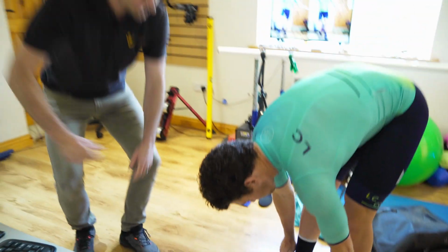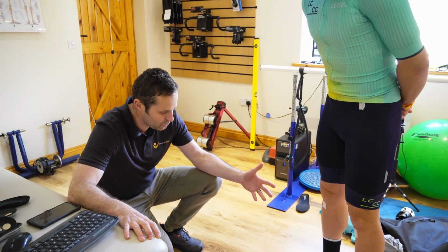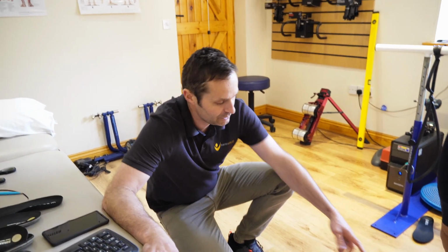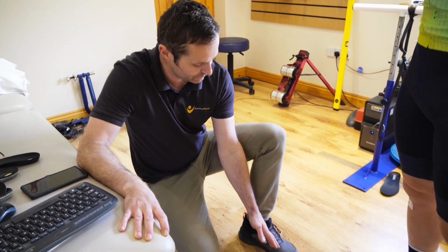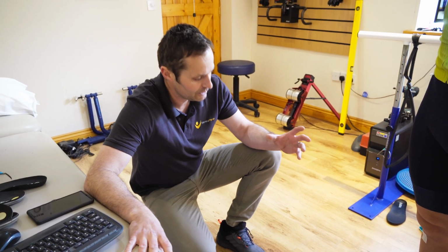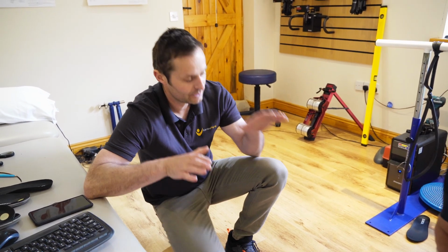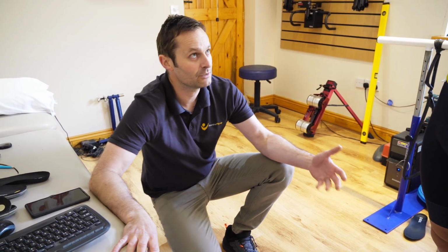So with a road cycling shoe, you naturally want them to be stiff and rigid because of the biomechanics of the sport. You're fixed in the bike. If I was to make a set of footbeds for a runner, for example, you need to factor in the fact that your foot naturally lands on the outside of your foot, and it rolls across the midfoot, and then you toe off your big toe when you run. So you have to take into account that natural movement of the foot when you're running. But with cycling, the biomechanics of it is literally keep your foot and your ankle nice and neutral, which is going to give you that platform that you need to deliver the power.